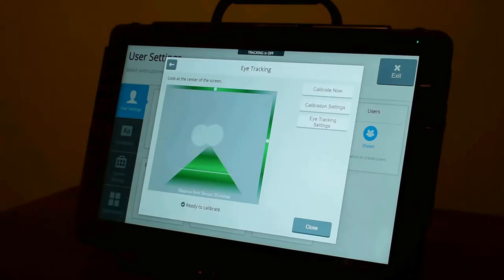The positioning window will give you some indicators as to your positioning. At the top, you have your horizontal positioning left to right. The goal is to get these dots into the center. On the right-hand side, I have my vertical positioning, my height. Again, I want that centered along the y-axis.